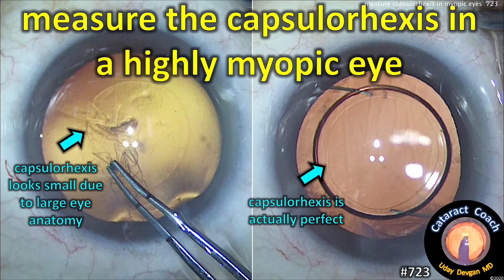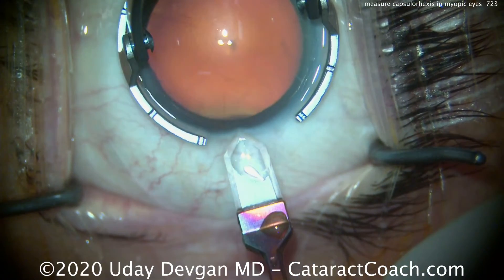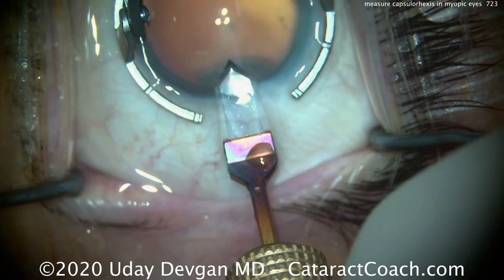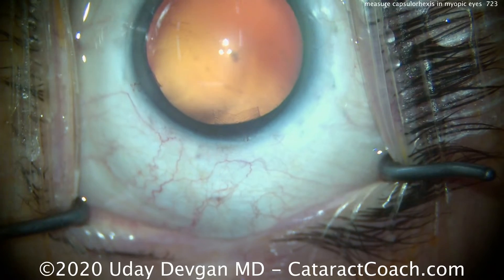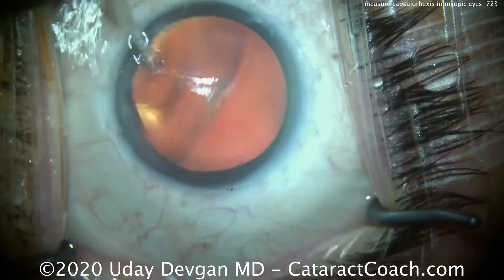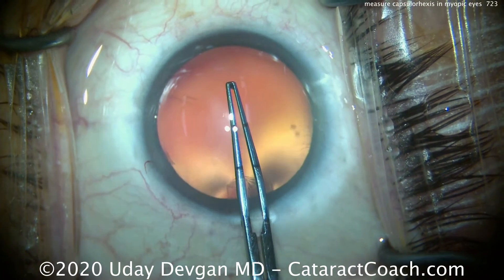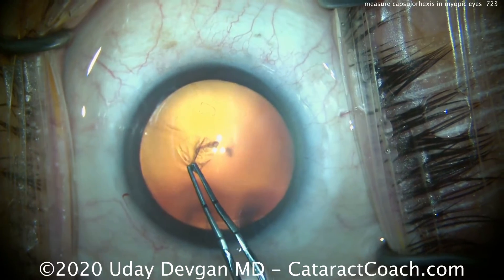Measure the capsulorhexis in a highly myopic eye. Maybe a small capsulorhexis can end up being just about perfect. Look how big the white-to-white measurement is — this is a 2.75 keratome and it looks very tiny. The white-to-white means that the cornea fills the entire fixation ring. This is a very big eye, a very myopic patient. So at the beginning, we're going to measure out and get a mental idea of where we want the capsulorhexis centered.